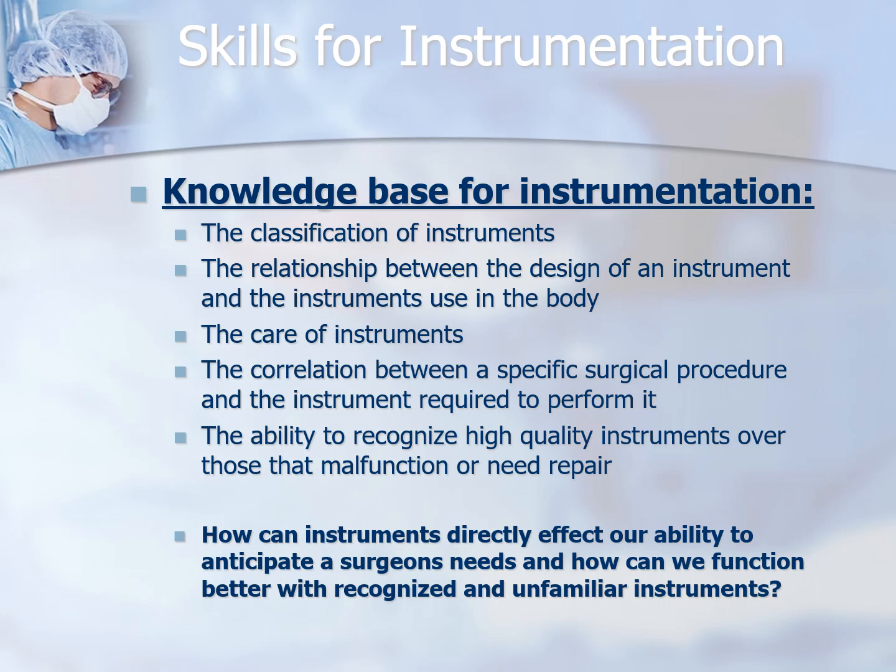It's our job to know what the surgeon needs. It's also our responsibility to know how every instrument works and what its function is, and be able to get it to the surgeon in an effective way so that they can use it right away without having to fumble or fuss.